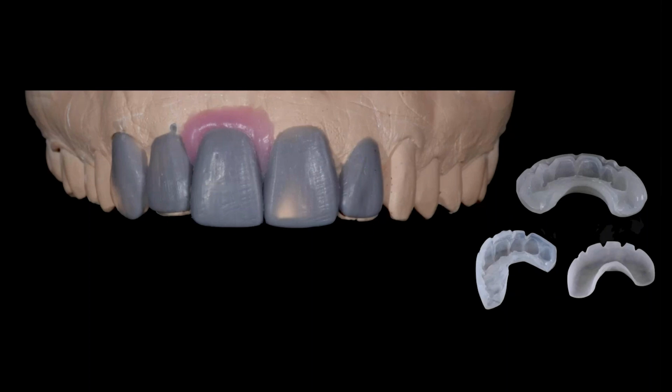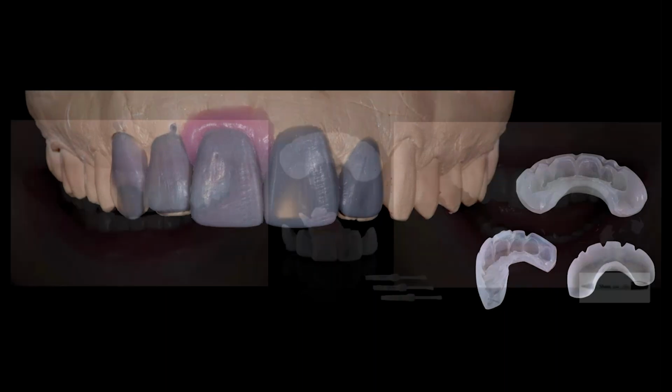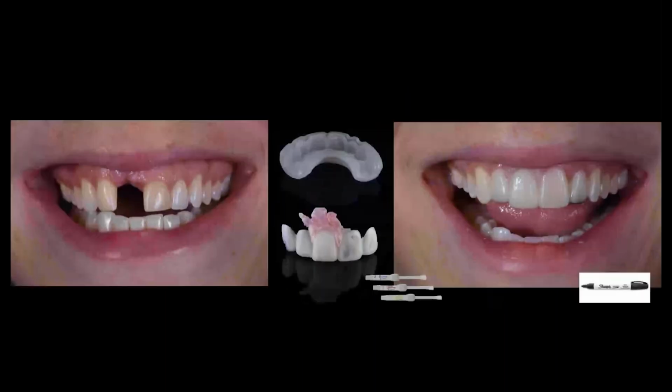So we did our wax-up, we did our wax transfer. The doctor's going to place that in the mouth. He actually took a black magic marker a little bit to the laterals. And when I saw her in the mouth, I felt like, you know what, the laterals don't need to be that short for her. We actually need to raise the height of the centrals a little bit more, but I think the laterals might be better tolerated longer. So the point of the aesthetic evaluation is to make sure that we understand what we did.